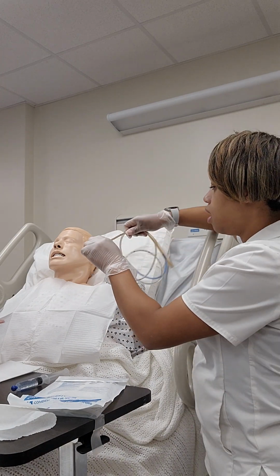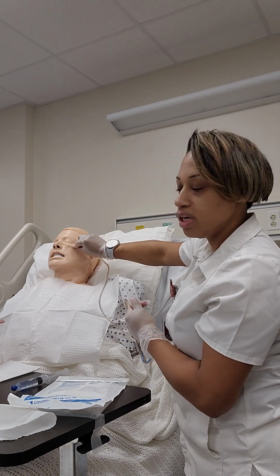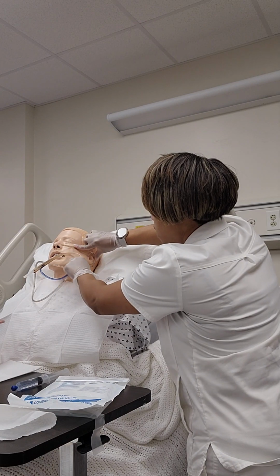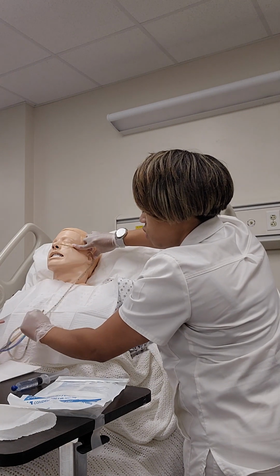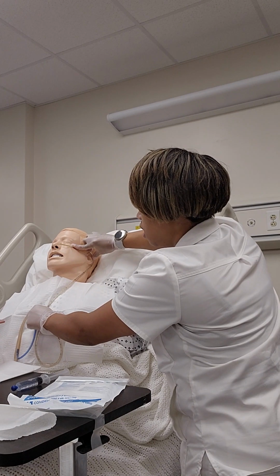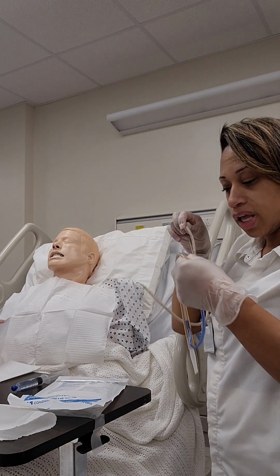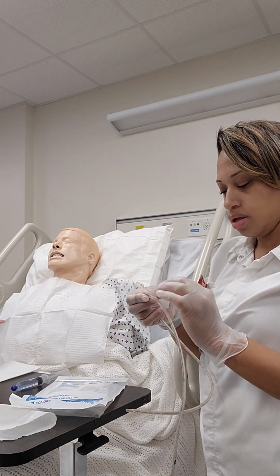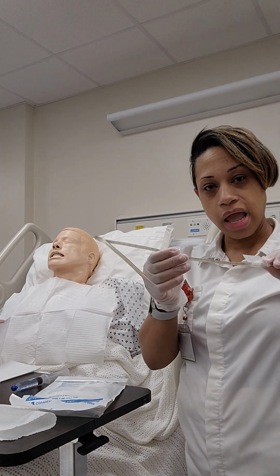I will measure it from the tip of the patient's nose to the tip of the patient's earlobe, and then to the tip of the xiphoid process. Now once I have that placement confirmed, I will mark it with tape, which I already had here. And that shows where I need to stop.